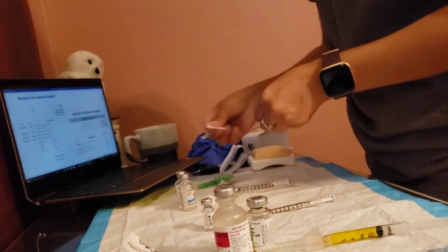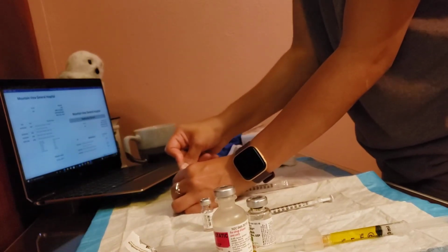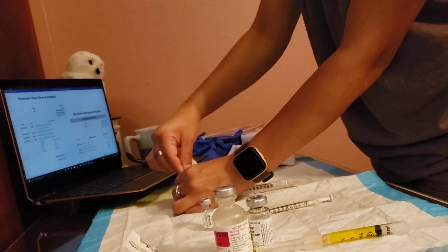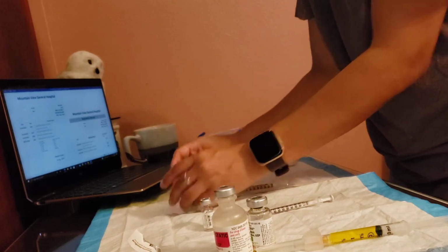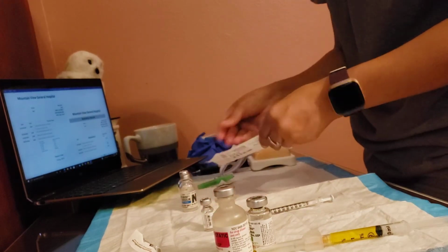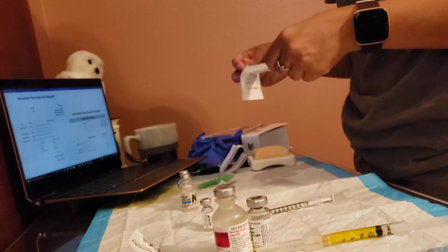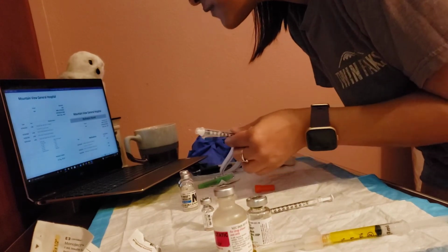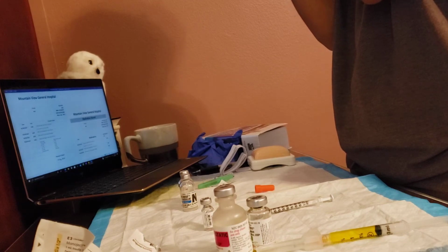I'm going to clean my vials, and when I did my dosage step, I saw his glucose was 389, and that I was going to need 12 units of regular insulin. So in my med chart it says 12 units of NPH, so I'm going to draw back 12 units of air.